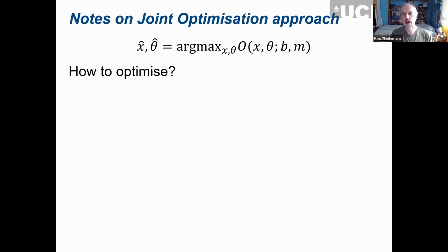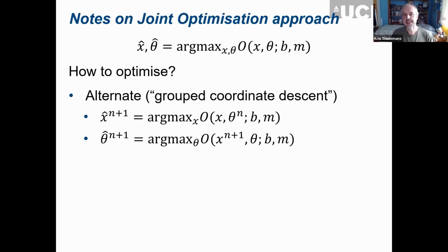Okay, so I now have a joint prior that tries to put some structural similarity between the different images that you have. The question is now, how are you going to optimize this? What most people do is alternate anyway. They say, I'm going to freeze one image and try to find the other image. I've written it as maximization over here. Then you freeze that one, and you flip the order around.